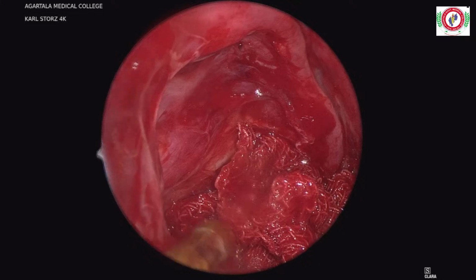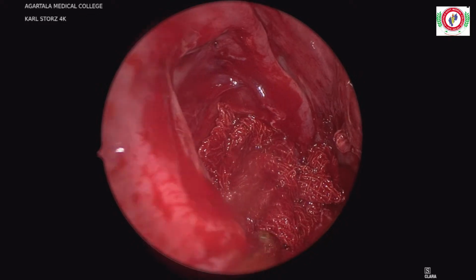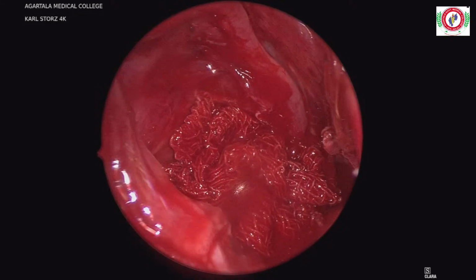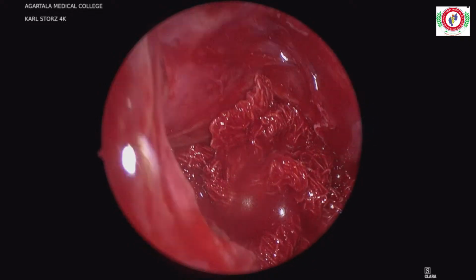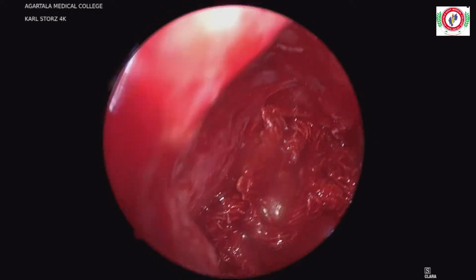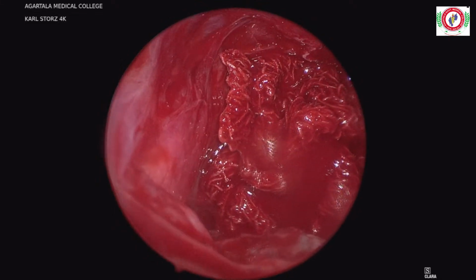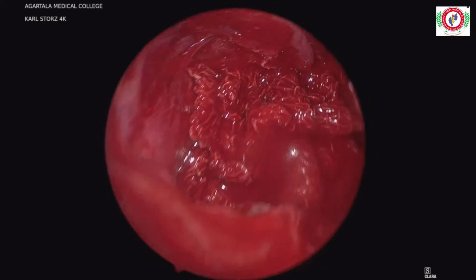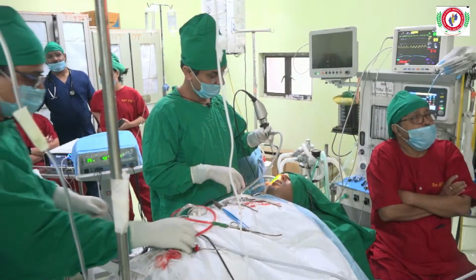But the problem with that blade is that the cutting surface is posterior on that blade. So it's actually the adenoid blade. Now the cutting surface should be on the anterior surface, not on the posterior surface. You have backbiting? So that is with the 45 maximum, I can show you with the 45 there. So that is the tumor that is left anteriorly.